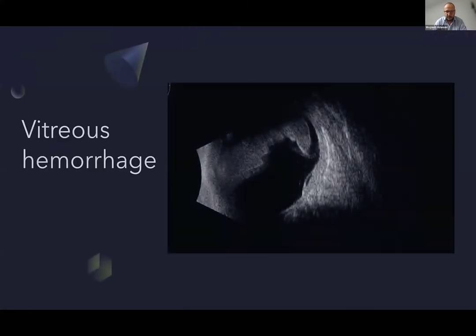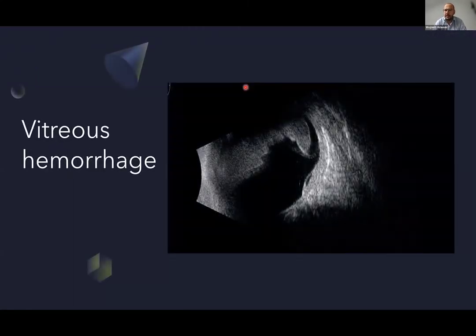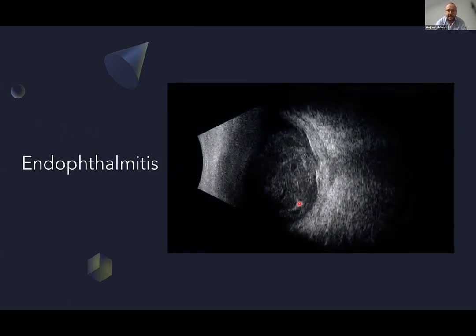Obviously, some of our patients that will come saying, I have floaters, will have vitreous hemorrhage, which is blood being present in the vitreous body. Here we also have blood underneath the retina, so probably a vitreous hemorrhage associated with hemorrhagic age-related macular degeneration. Sometimes I get questions, can you determine if the opacities in the vitreous are associated with a hemorrhage or an inflammatory process just based on the ultrasound image?